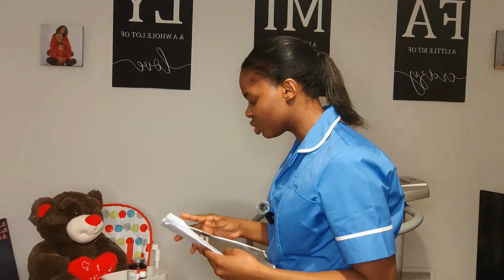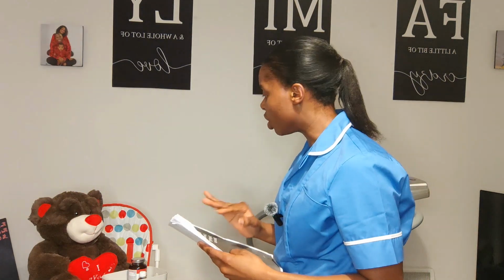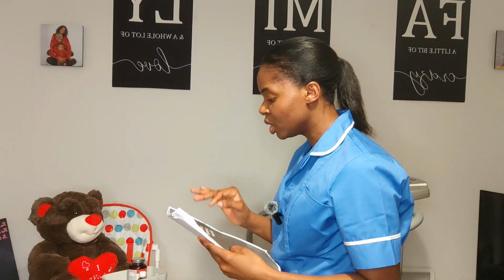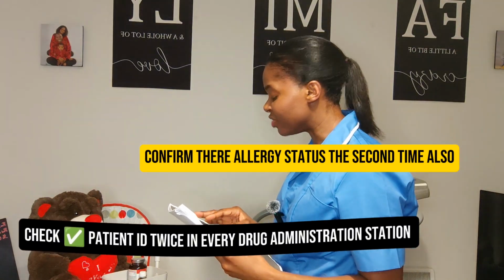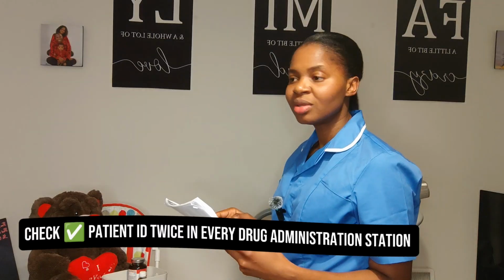All right, before we continue, could you please confirm your full name and date of birth while I double check with my paperwork, please? Okay, so I still have here Janet James. All right, your date of birth is 01/01/1992, and your first line of address is 27 Dalton Grove. Then your hospital number is 1234567. It's properly documented here. So, assessor, I am still with the right patient.